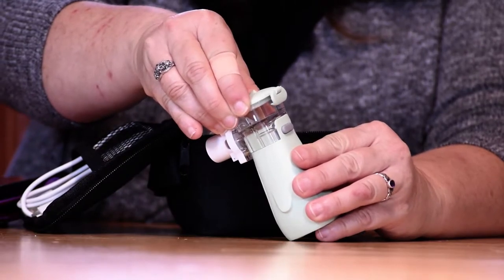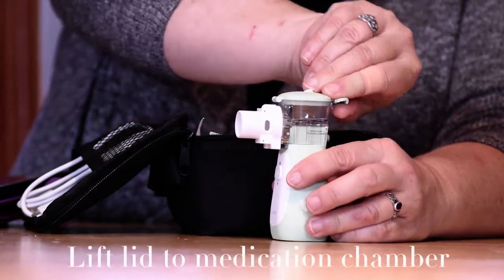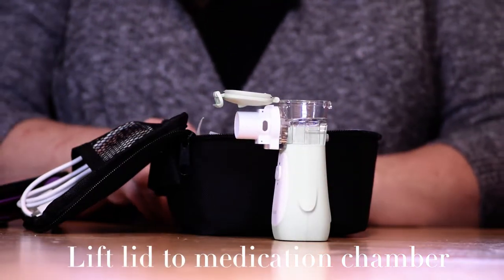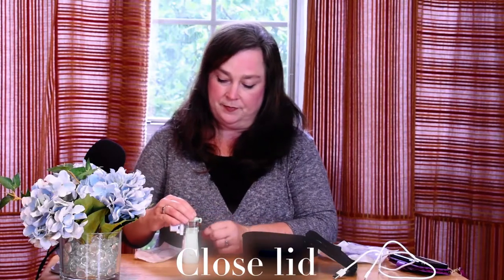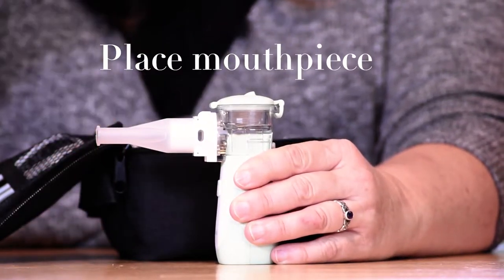This device is fairly simple to use. You will lift this latch and the lid into the medication chamber, put your medication into this cup, close the lid securely, and place the mouthpiece. Now you're ready to use the device.